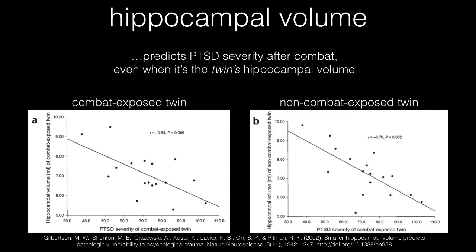So now that we've covered the mechanics of labeling voxels and calculating volume and cortical thickness, let me try to convince you that this is all worth your time. In the next few slides, I've excerpted some interesting volumetric findings from the literature. This first finding is from a 2002 Nature Neuroscience paper from Harvard and the Boston hospitals.